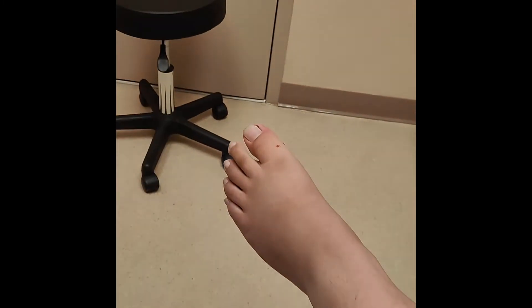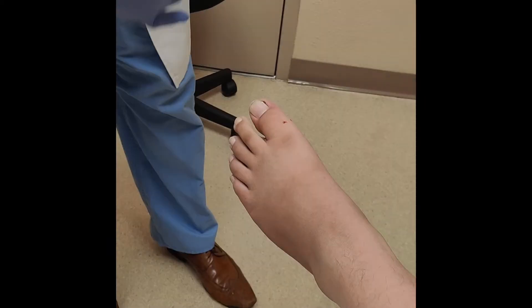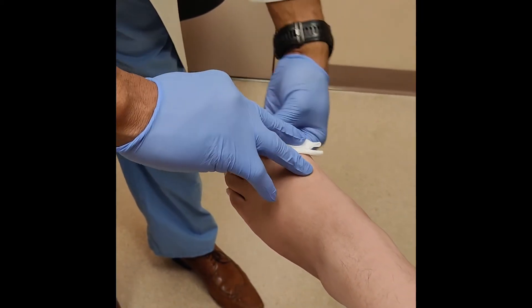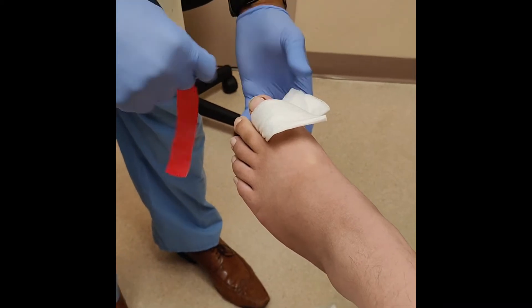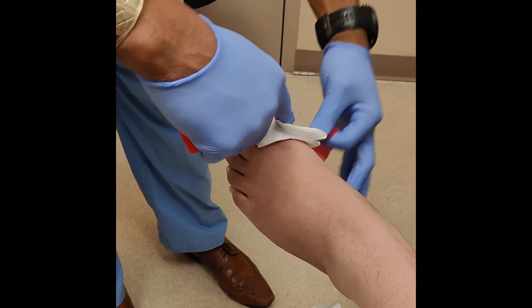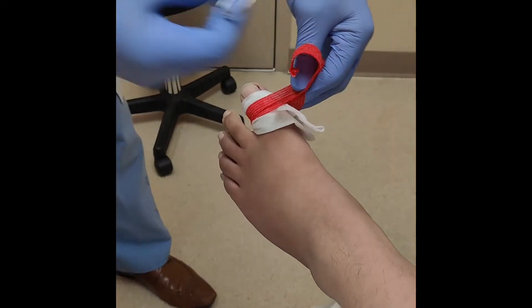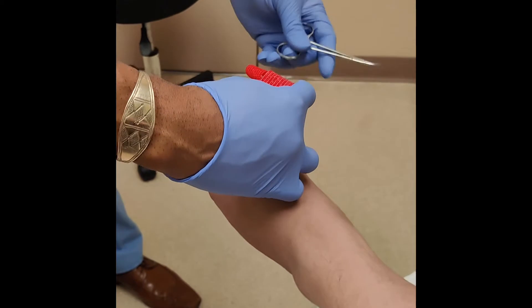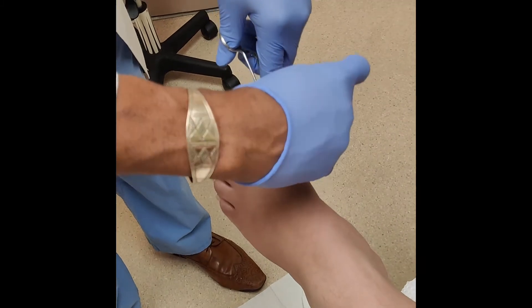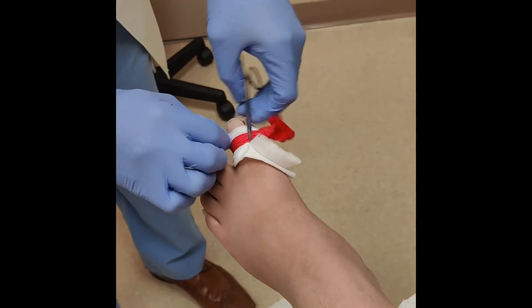All right, we're almost there. Let's get this guy, unless he starts to scream. Okay, that's just a makeshift tourniquet to prevent it from bleeding too much, so neither you or I pass out.